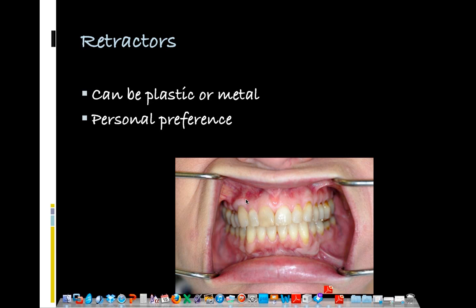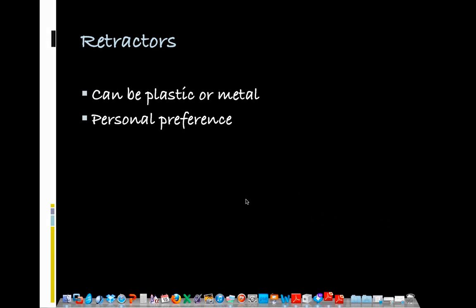By the way, you notice in this picture there's a cant. Important to capture the cant as it is. And you have to look outside of the camera, look with your eye and see the cant and capture it appropriately. Because in ortho or restorative dentistry or in oral surgery, if you're doing any sort of surgery, the cant is important. And in perio, of course, if you're doing crown lengthening. So keep that in mind.